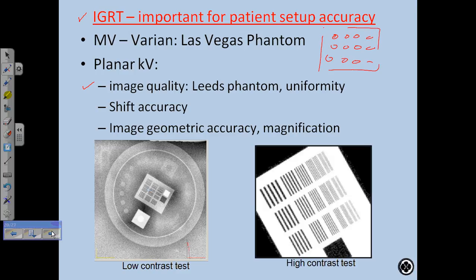And so the image quality tests, one of them is, is it up there? No. One of them is low contrast detectability. You have to be able to detect structures of low contrast, like soft tissue versus dense tissue. That's what these do. So what you do is you count how many of these you can see. You count the number, record it, and it has to pass within a certain tolerance. Okay. The other test is a high resolution test, and that's done with line pair tools.